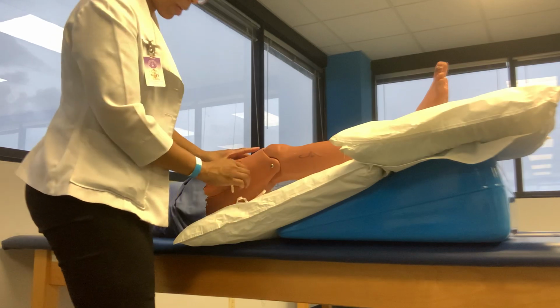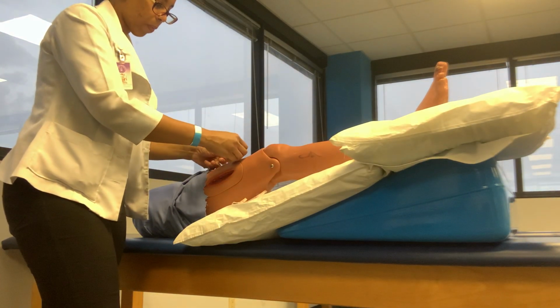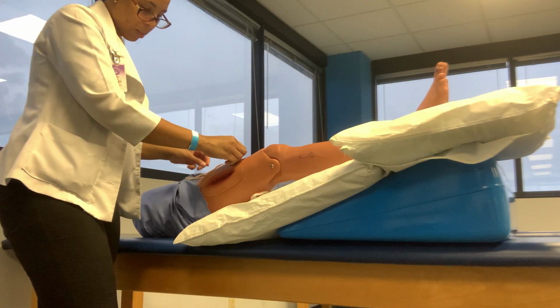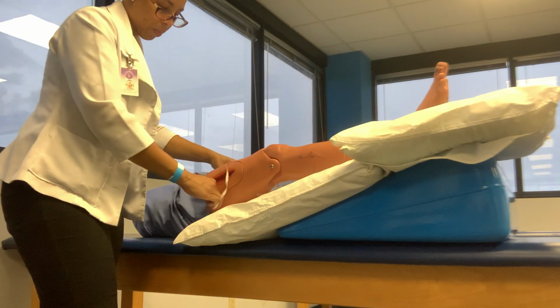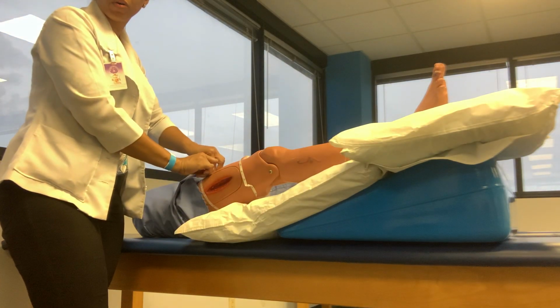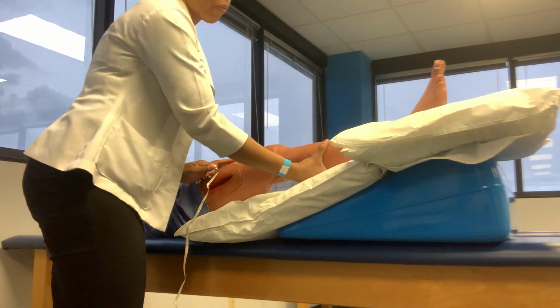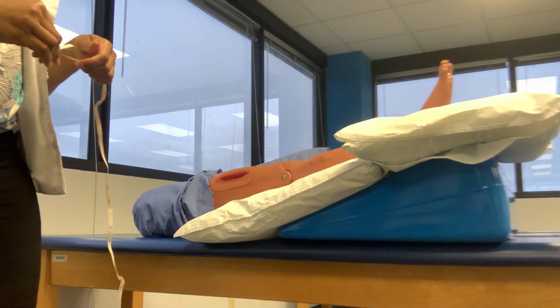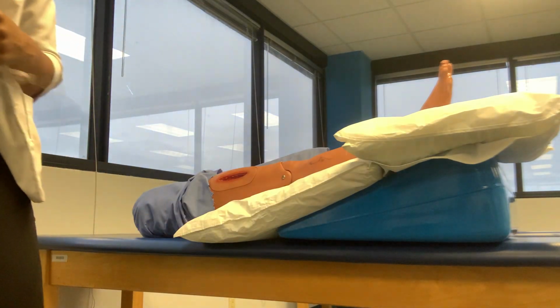And then depending on the patient's length of their limb, we do another 6 inches from there. So with this patient, I can't go all the way 6, so I would just stop at 4, otherwise I'd be in their groin, and I would take my girth measurements. So for the interest of time in your skills check, we won't go through all the smaller denominations. We're just going to do an estimated version.